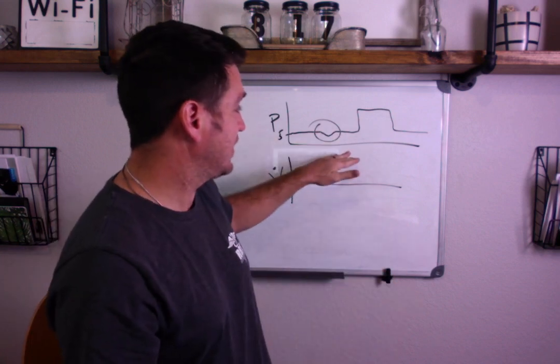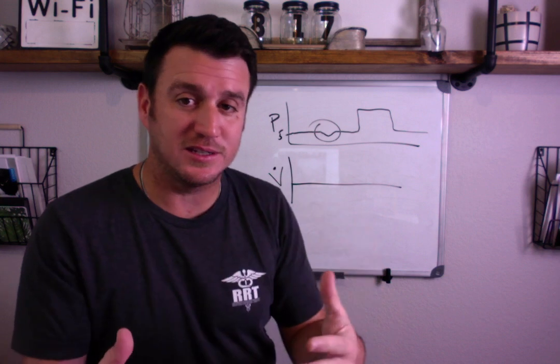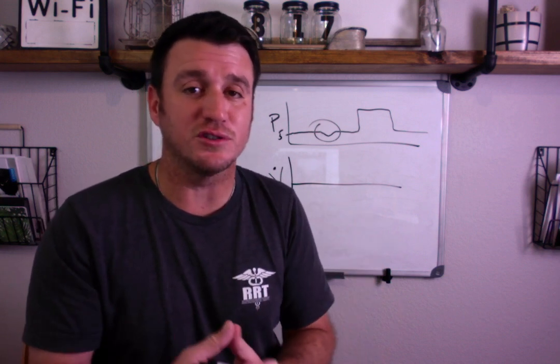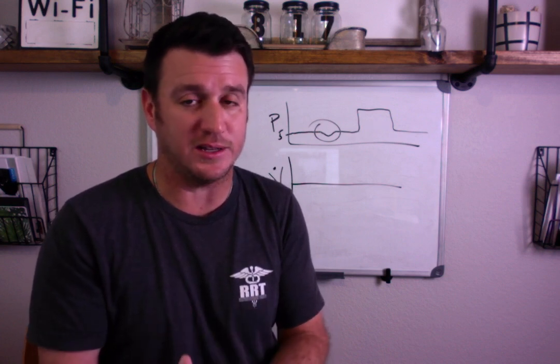There was no breath given here, okay? And so this would be indicative of a failure to trigger, which means your sensitivity is not set correctly.